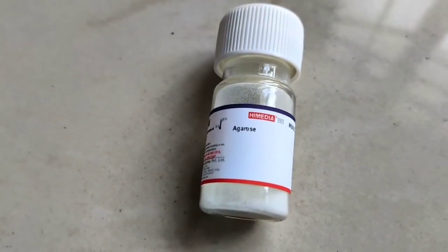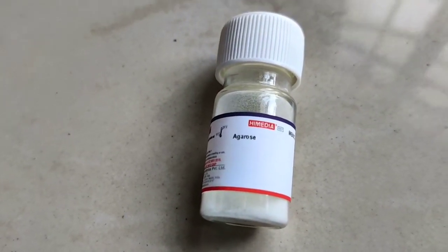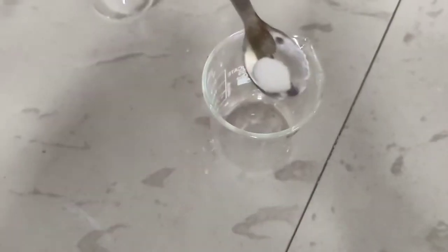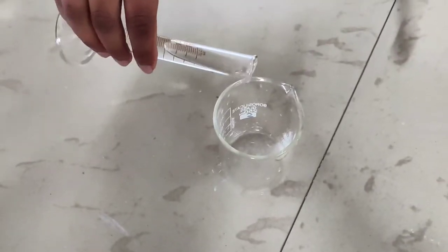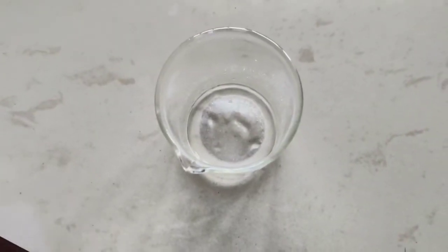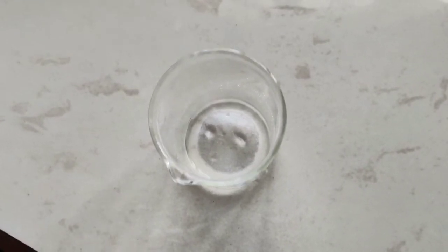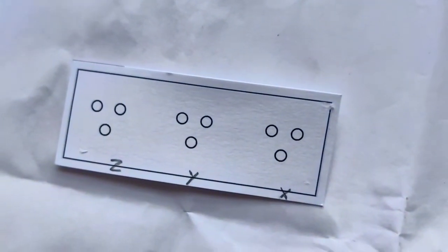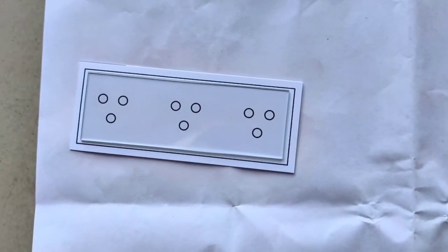Now we will prepare agarose gel. For that we need 0.1 gram of agarose powder mixed in 10 ml of 1x assay buffer. We will put this solution in an oven at 55 to 60 degrees Celsius. While the agarose gel is in the oven, we have cleaned the glass slab with alcohol and placed it over the provided template.